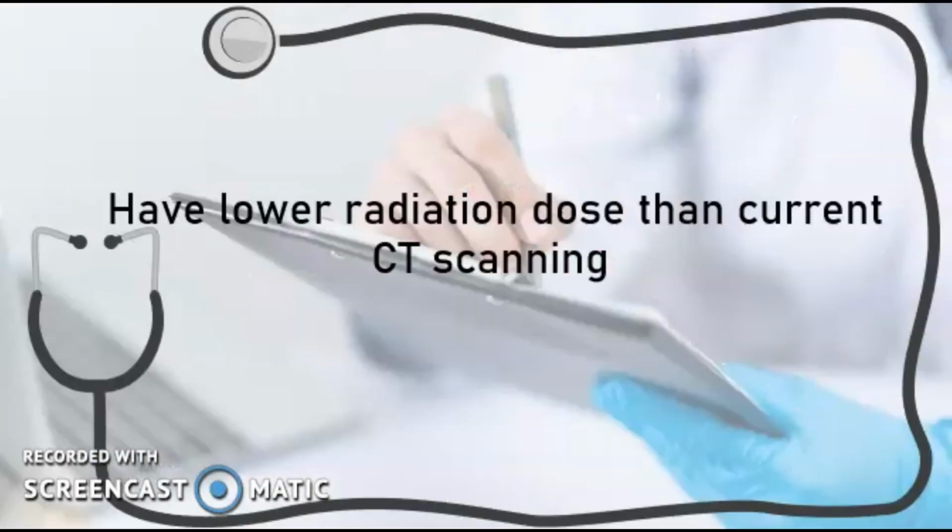Lastly, X-ray velocimetry technology has a lower radiation dose than current CT scanning. As we already know, to acquire detailed and high-definition imaging requires invasive methods such as radioisotopes and relatively high radiation doses, and this can increase the risk to the patient. So this may expose the patient to quite high radiation and increase the potential to develop cancer.